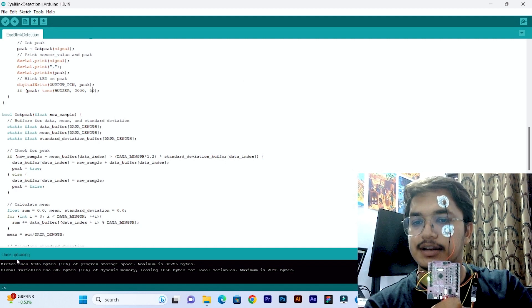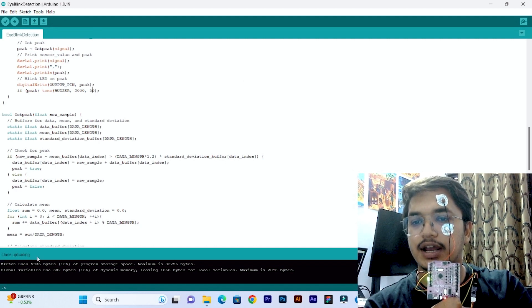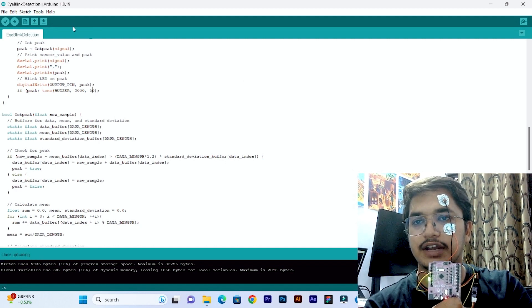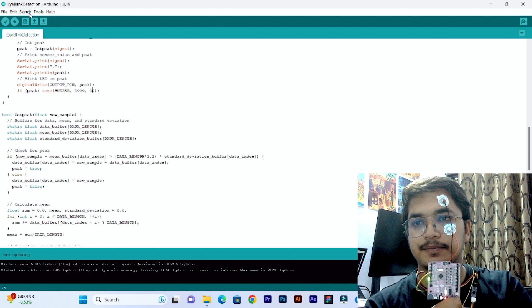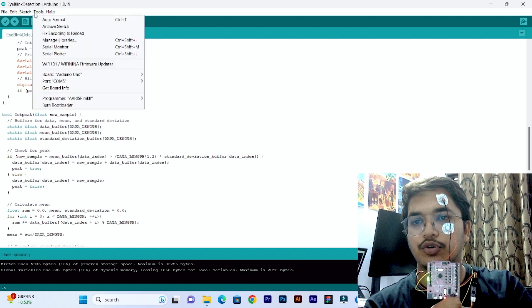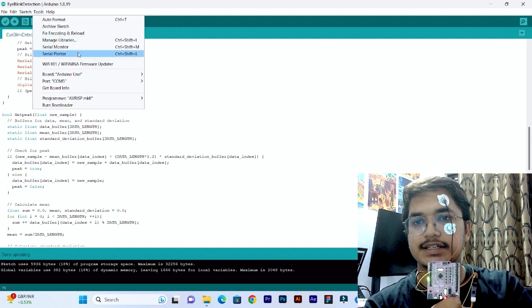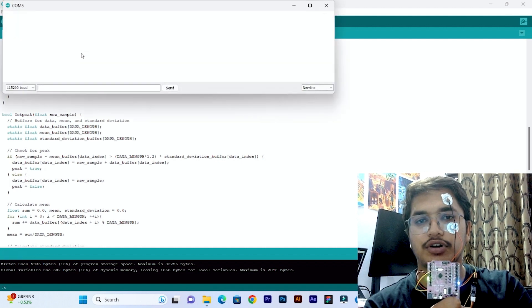It says done uploading, so there are no errors. We can go ahead. Go to tools and start the serial plotter.